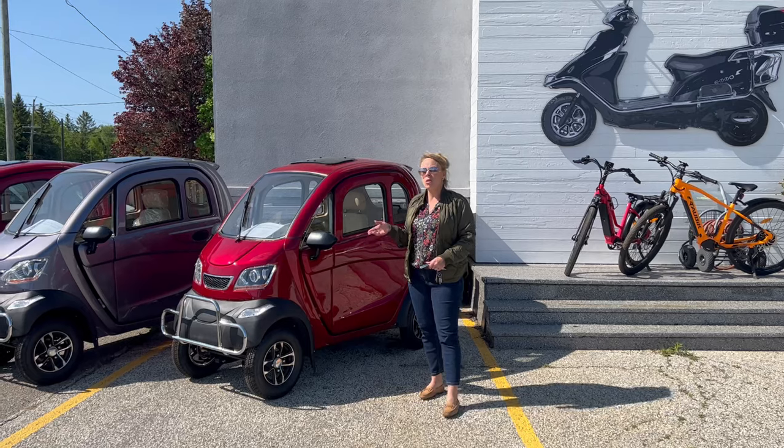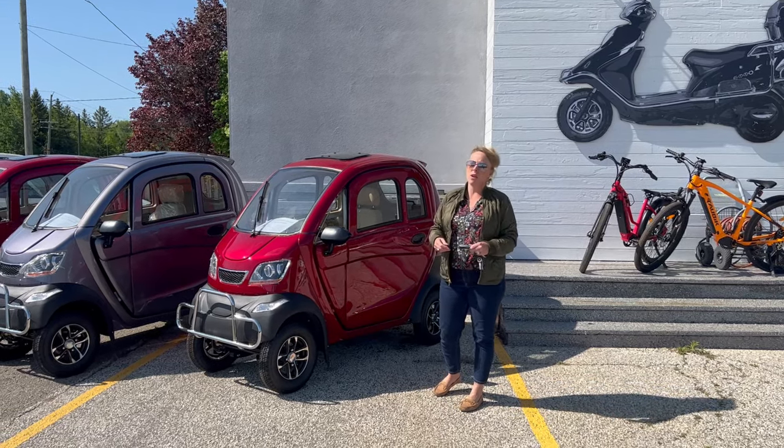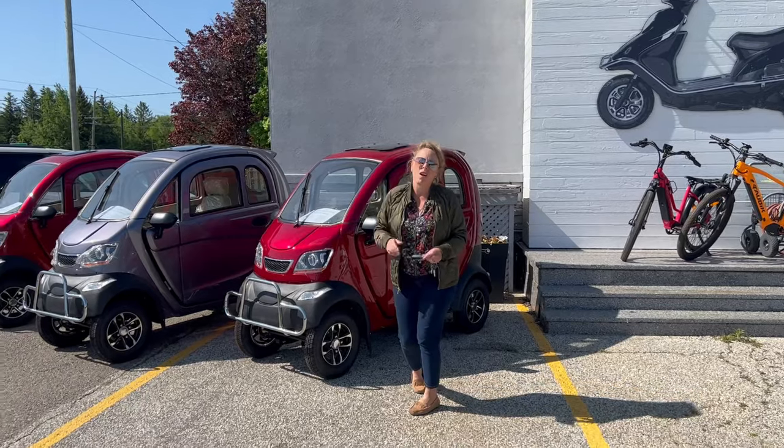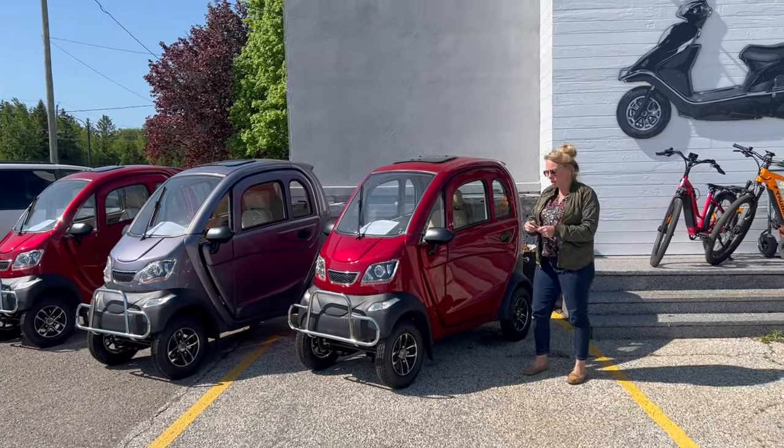So the Emo or E-cola Cruise. Here's a video on the features of these — I mean, they're not cars, they're mobility — enclosed mobility scooters.